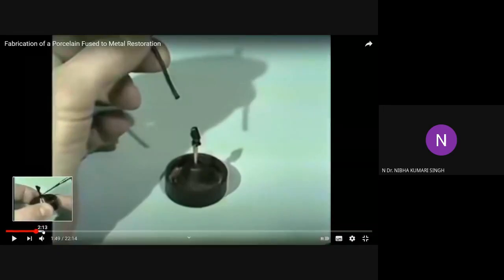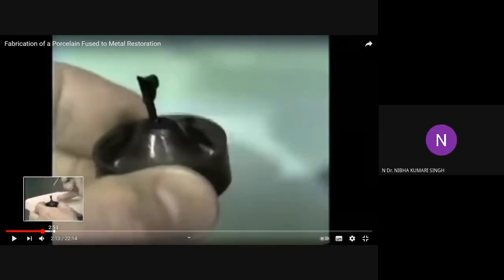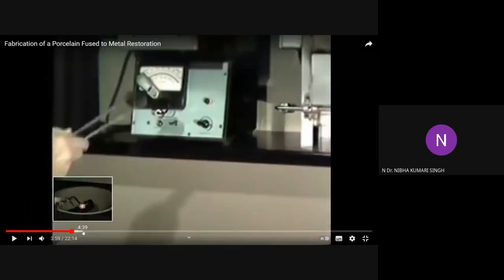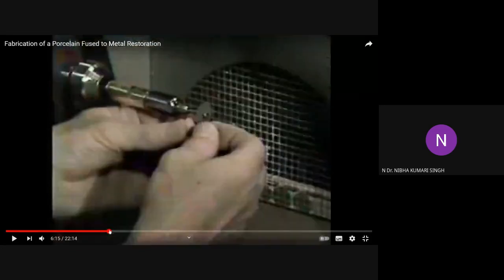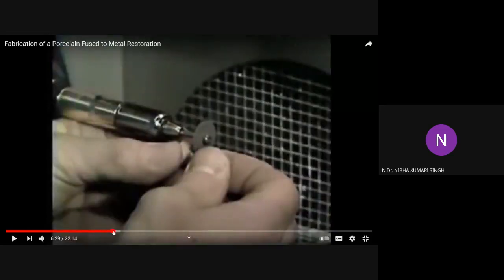So these all things you know, right? Are you able to see the video? Yes, ma'am. Yeah. So you know all this investing burnout procedure. This is all. So you know that metal crown is fabricated by any of the methods. Like either it may be casting, or electro deposition, or swazing, or CAD CAM procedure. Your metal crown is produced. After the metal crown is produced, you have to do the just a minute. No?